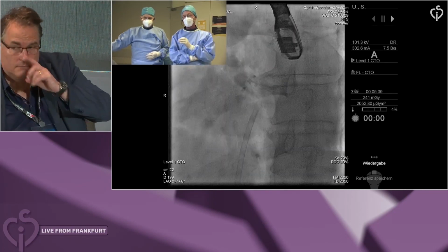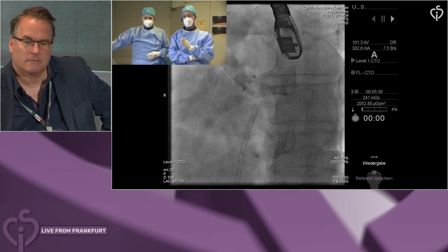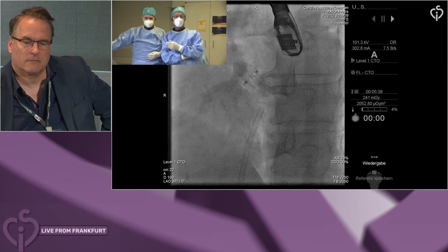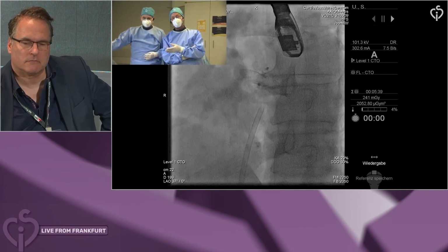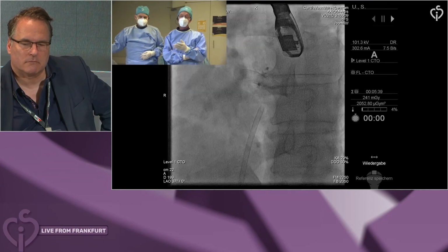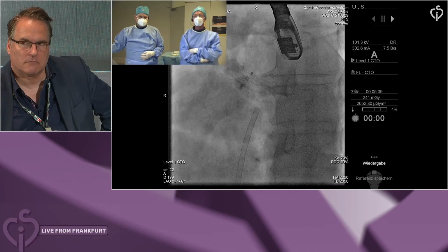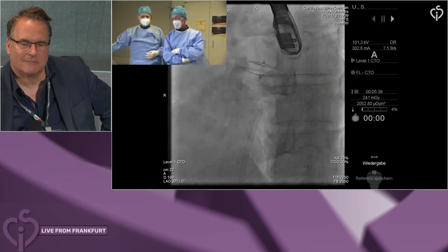With that device, we had a patient who had a late erosion and was actually admitted to another hospital. They did pericardiocentesis, and then the bleeding stopped, and they did not send the patient to surgery, and he was doing fine 5 years later when I saw him again. So that means surgery is not always necessary, although very often, of course.